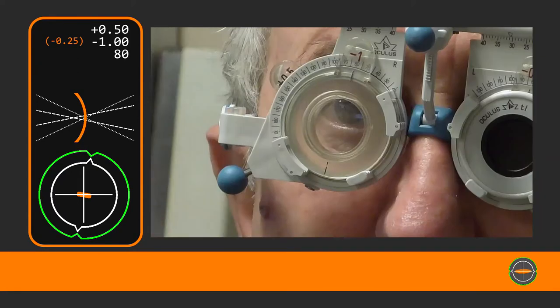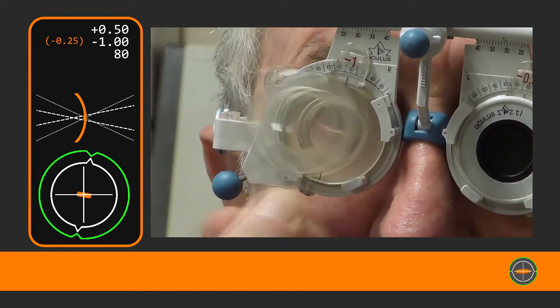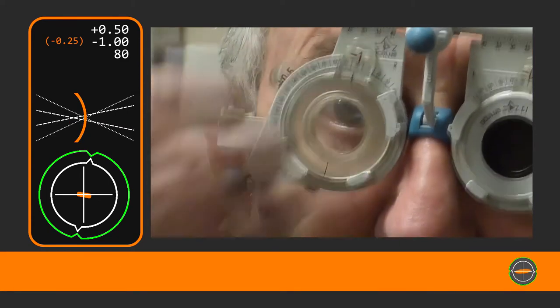Very subtle. That's with it in. Or if I just take it away. In. In. Yeah. Perfect.